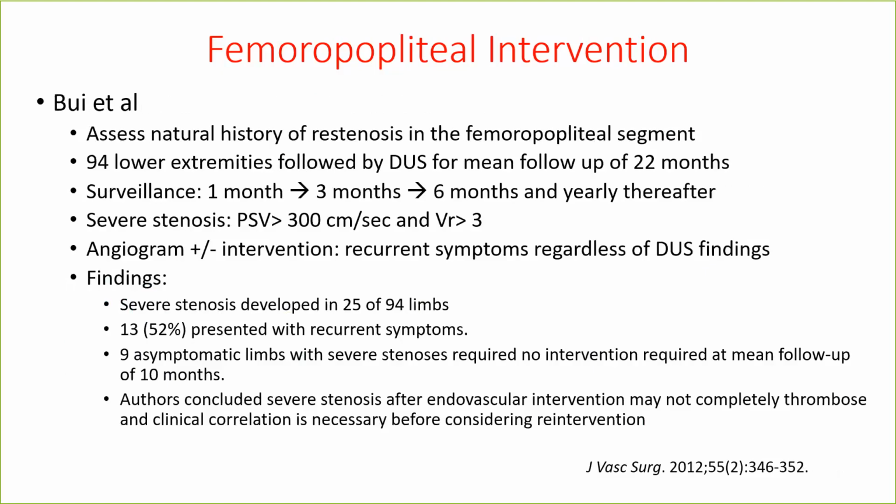This study tried to assess the natural history of in-stent restenosis in the femoropopliteal segments, or just post-stenting, what the natural history is. They did re-interventions only in patients who had recurrent symptoms, regardless of the duplex ultrasound findings, but all received surveillance duplex ultrasound.